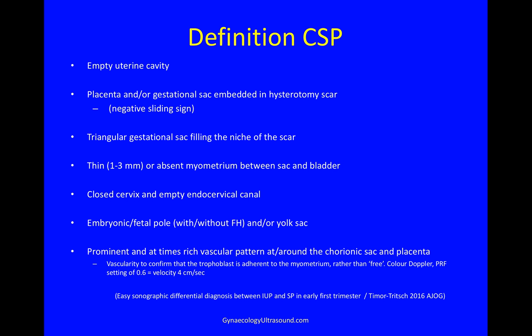The internationally agreed definition of a scar pregnancy is that the uterine cavity itself is empty. The placenta and/or gestational sac is embedded in the hysterotomy scar, so the sliding sign is negative. There is a triangular gestational sac filling the niche of the scar, and a thin or possibly absent myometrium between the sac and the bladder. The cervix should be closed and the endocervical canal empty. You will see an embryonic or fetal pole with or without fetal heart, and/or just a yolk sac. The vascularity will be prominent and at times very rich at or around the chorionic sac and placenta.